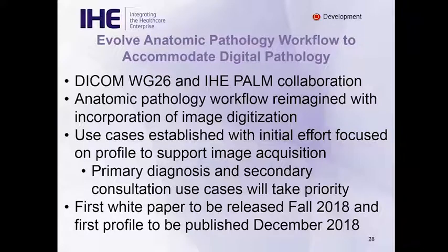All right, anatomic pathology, of course, is changing with the advent of the FDA announcement of the first approved digital pathology system for primary diagnosis in the United States, and other countries already having moved forward with digital pathology systems and architectures. The glass slide is no longer becoming the norm for microscopic diagnosis.